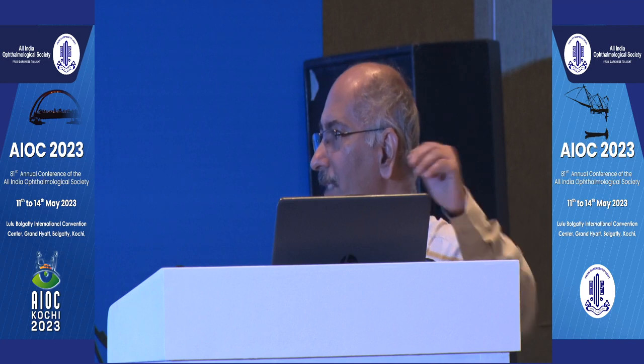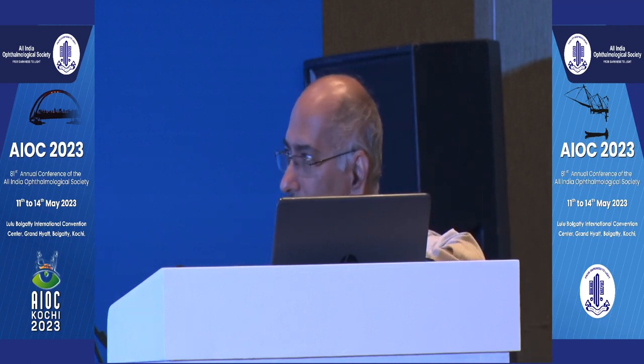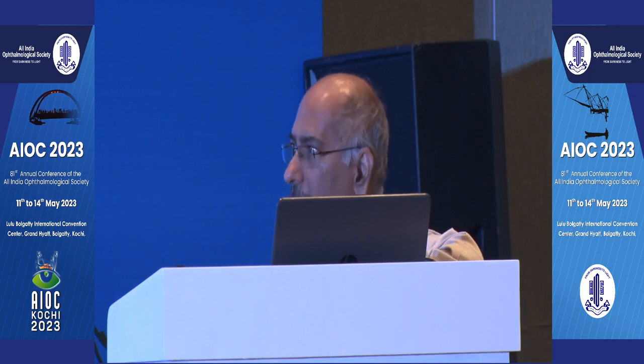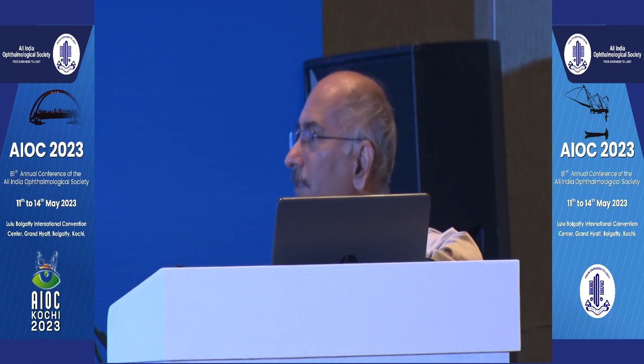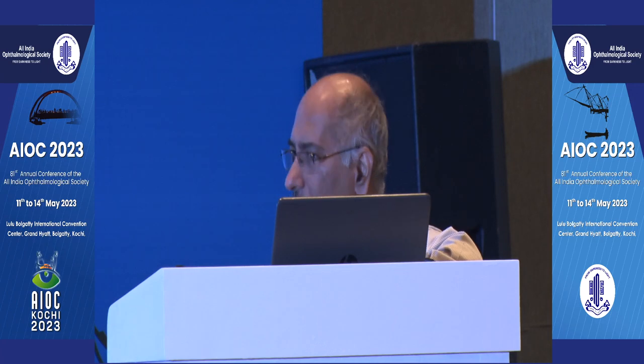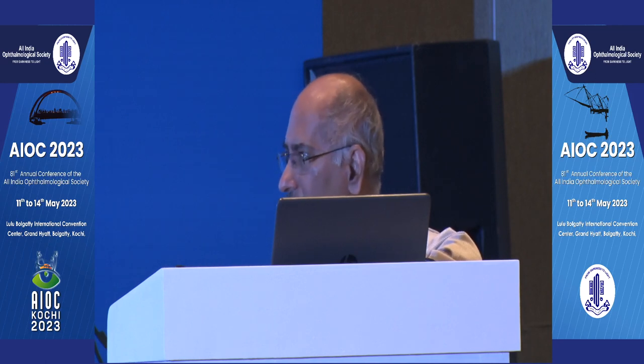So you're planning another surgery? Basically, this is going to be a work in progress. The retina is fully attached just now. Some of those contracted folds will settle. Eventually, I know that it's going to get re-detached at places, but then I'll be faced with more mature membranes. There will even be a requirement of retinectomies at certain places where the contracture just doesn't release.